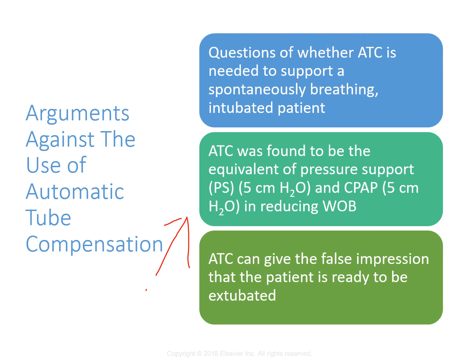Here's the big bullet point. We need more studies to determine whether tube compensation provides all the benefits that it was designed to do. So we just need the evidence there. But there are some concerns that it may under-provide support or may over-provide support as well. Right now it's just one other method that can be used successfully to extubate patients who are difficult to wean. So if you're having trouble getting a patient to wean and you have a ventilator that has tube compensation, it is an option for you.